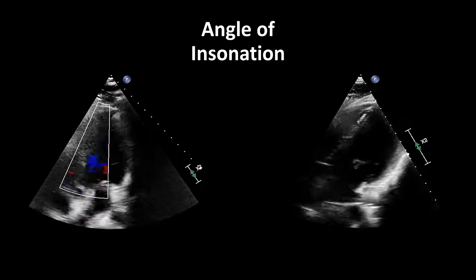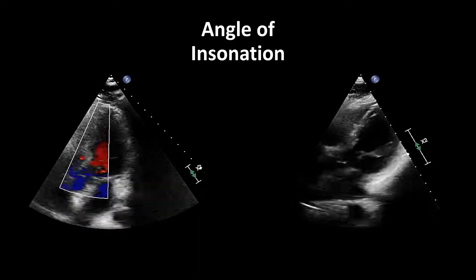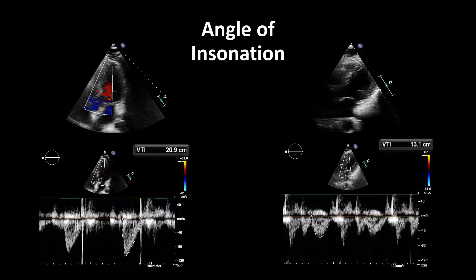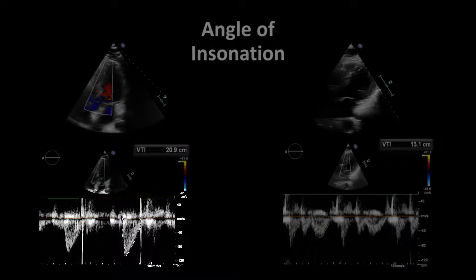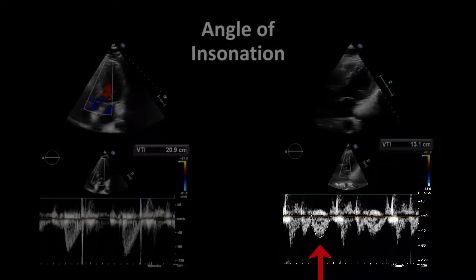Let's go over a few examples. On the left, we see a nice apical five-chamber view with color Doppler showing the LVOT, and on the right, we have an off-axis five-chamber view. When you go to obtain your VTI, your Doppler line of interrogation is quite parallel in the left image and you get a beautiful VTI. A good sample has a narrow envelope with a bright white outer edge and dark black blood flow inside. Seeing the aortic valve closure as a bright spike tells you you're perfectly located just proximal to the aortic valve. On the right, because the heart's off-axis, the Doppler flow is not parallel, giving you an underestimated VTI of 13 — the envelopes have quite different morphology.